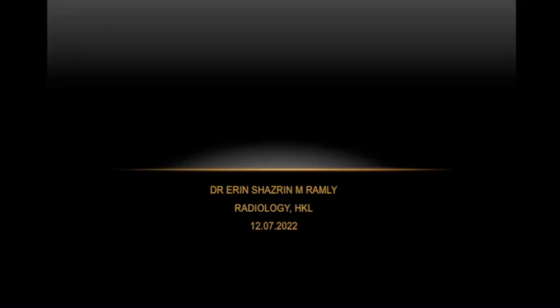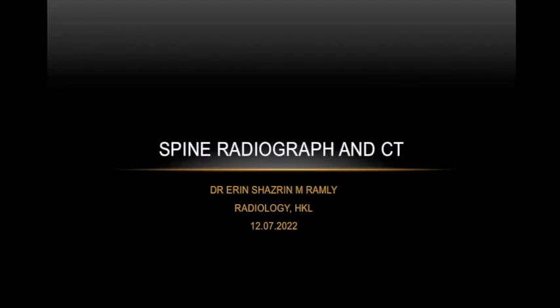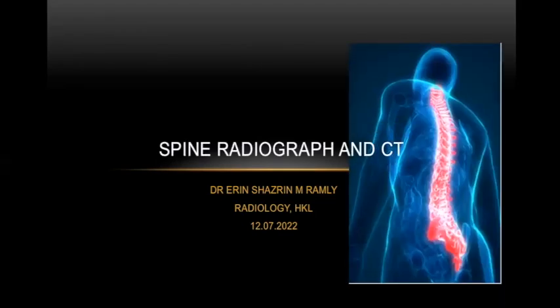So the topic of our CME today is spine radiography and CT. And I will be focusing on radiograph and CT in the setting of trauma, because you guys are in ED, selalunya kita tengok all the trauma case kan, most of the time.